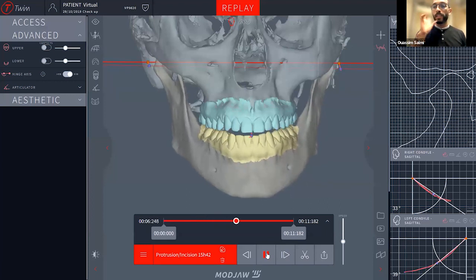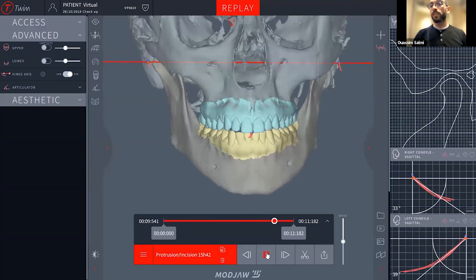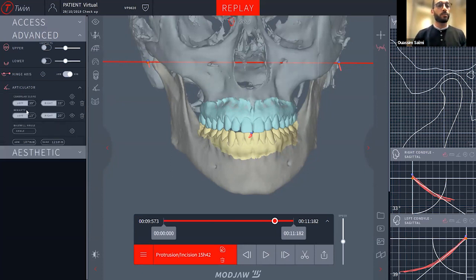So in terms of analyzing where the condyle is, if we want to take it to the next level to discuss, for example, when you change the position of the lower jaw, or maybe after a treatment, to check where the condyle is, there is no need anymore to do a second MRI or a second radiography. You have it in here, you move it, and you will see it in the 3 planes of space. And you also have the articular parameters that are automatically measured inside the software. You don't work anymore with average values.